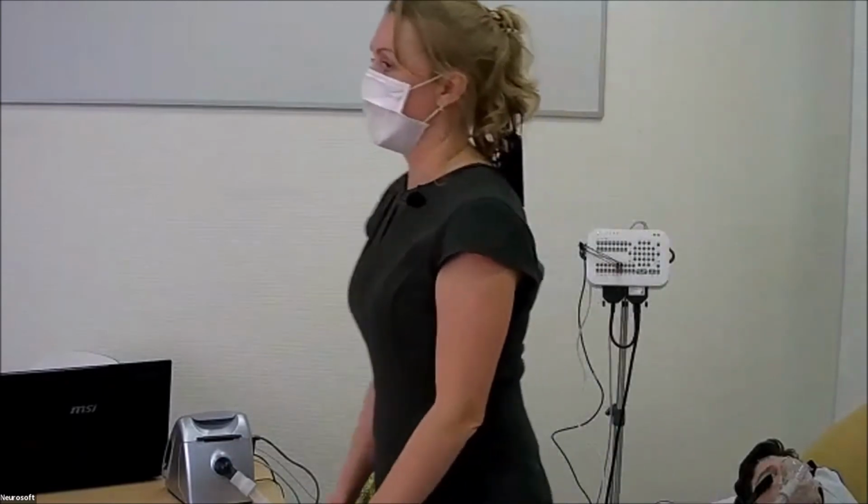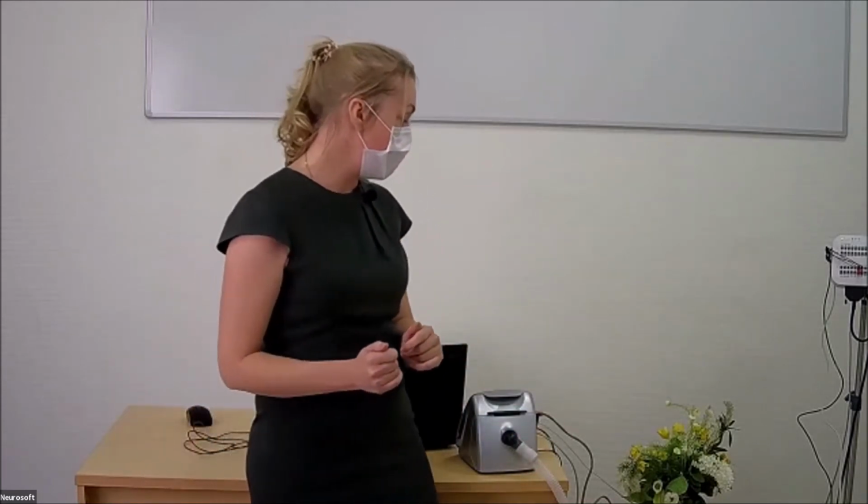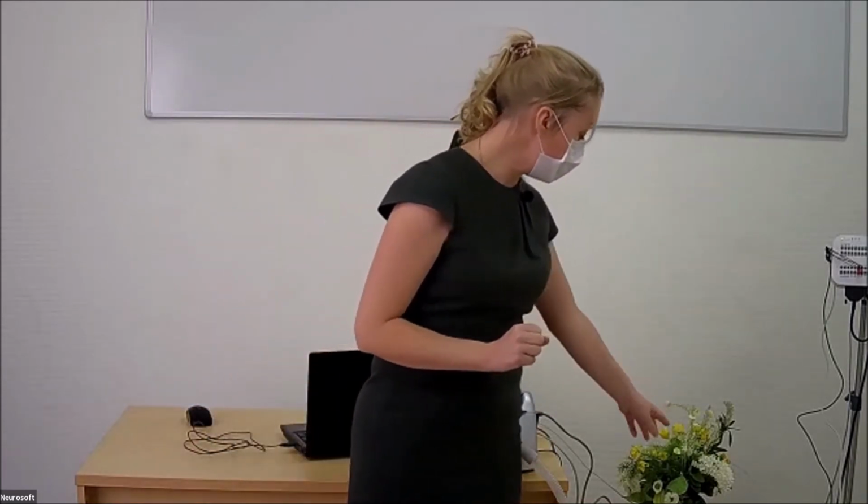So this is another way of transferring information from the PAP to our PSG system. It is the application of this special module. But we can connect the module to DC channels only.